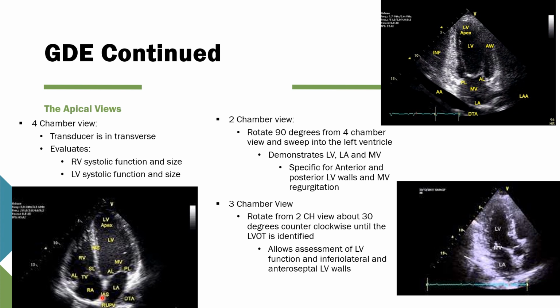If you have the software packages on your equipment, you can even do an ejection fraction where you're going to be measuring basically the lumen of that left ventricle during diastole, and then freezing it again and measuring during systole to see how effective it is ejecting blood from that area. So that is one option that you can do, again, if you have the software package. If you don't have that, at least you're getting an evaluation. You can look and see if there's any pericardial effusion.